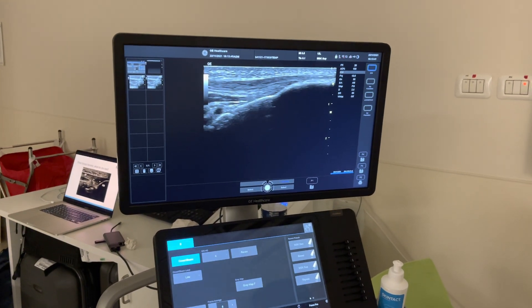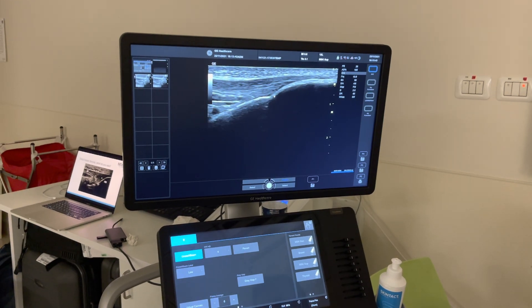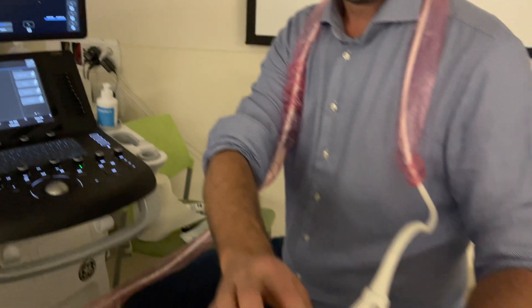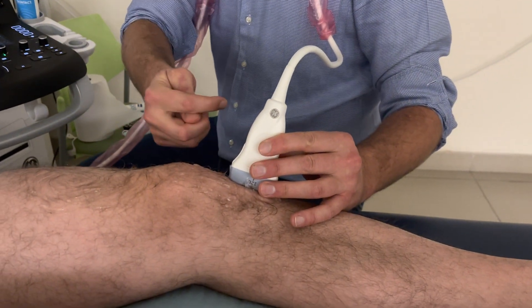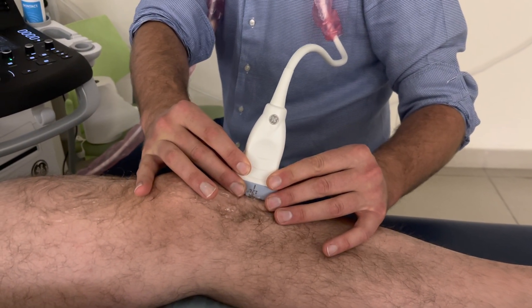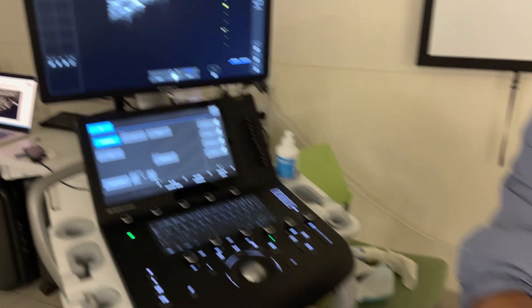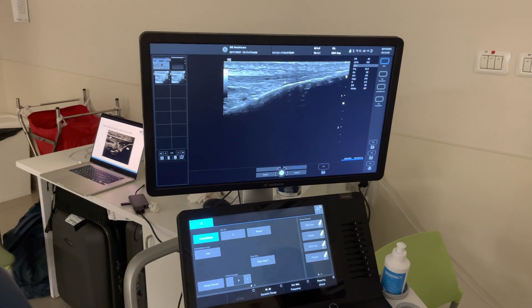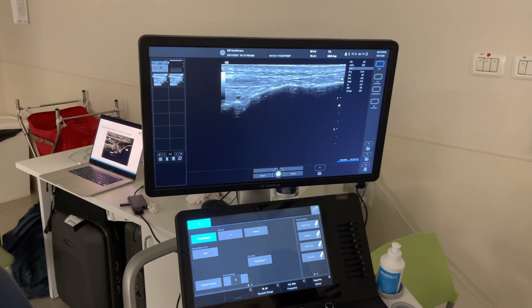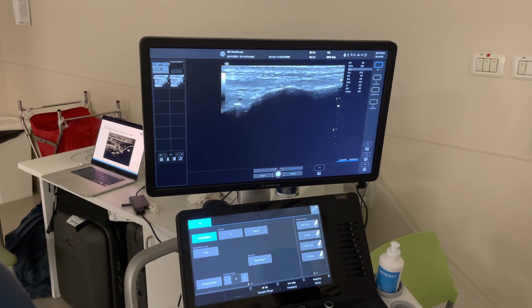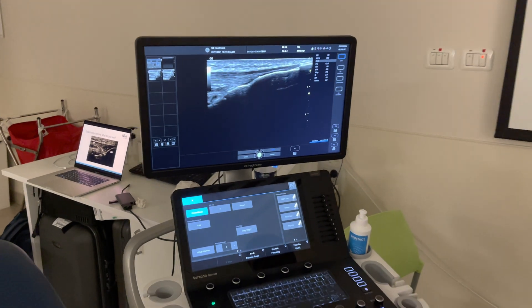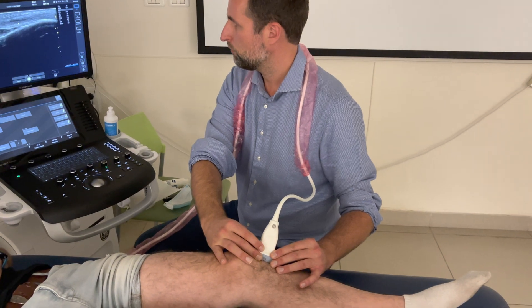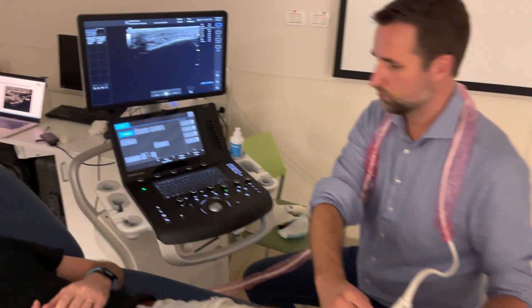Important to know that this tendon is almost two and a half centimeters wide, so if you want to scan the tendon you should make sure that you also go medially and laterally. I'm going to go medial first, continuing medially until we don't see any tendon tissue anymore — it's getting thinner and thinner and it's gone. Then I go back and go lateral, further and further, until it stops.